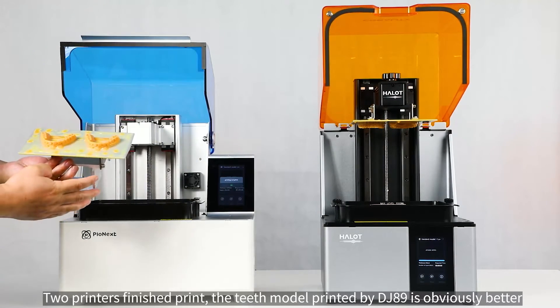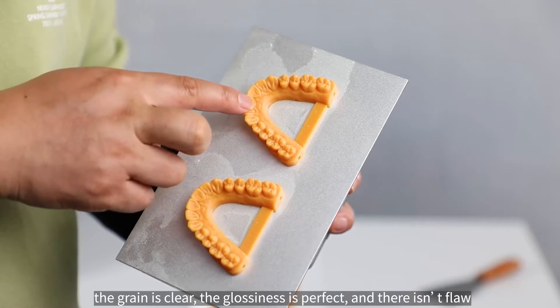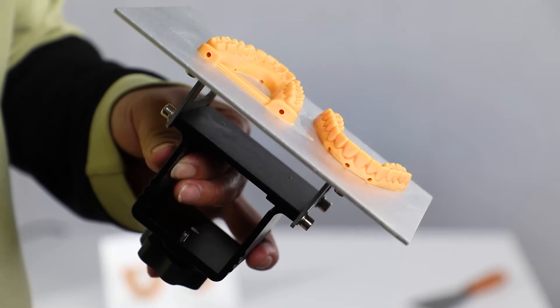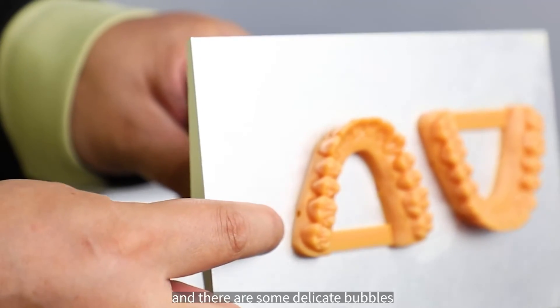Both printers have finished printing. The teeth model printed by DJ-89 is obviously better — the grain is clear, the glossiness is perfect, and there are no flaws. On the HALOT, we can see distinct layer separations on several layers and some delicate bubbles.